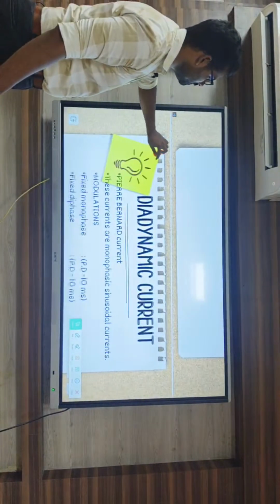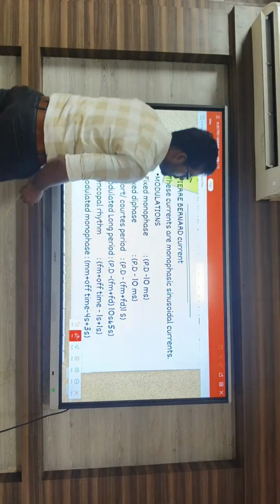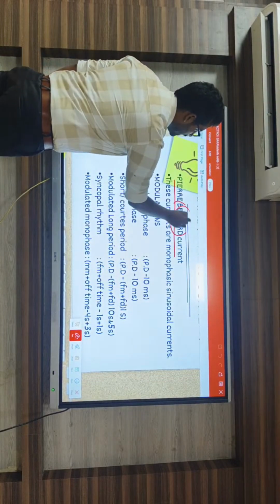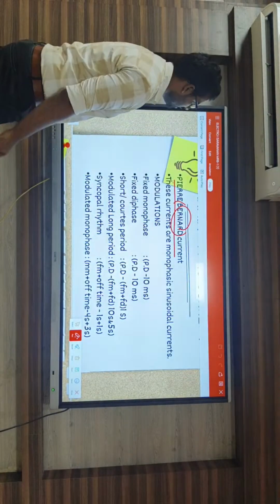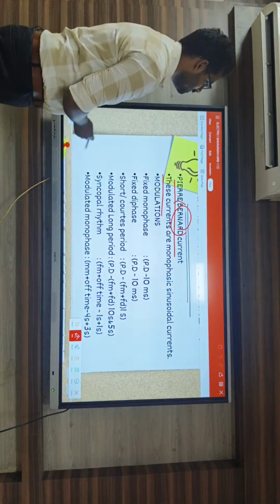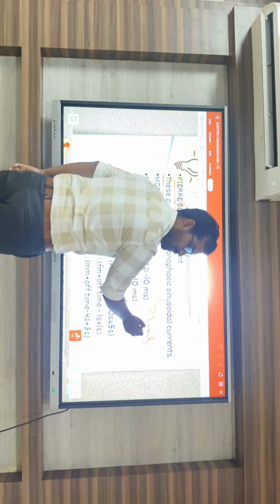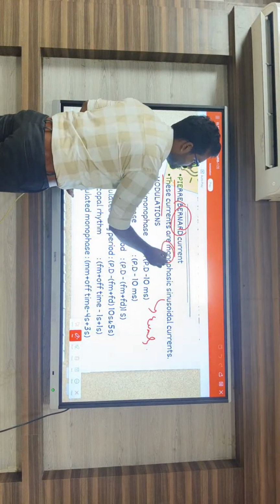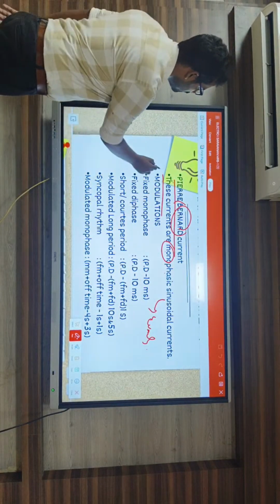Next we'll move on to the diadynamic current, otherwise known as the Pierre Bernard current. Bernard is the only candidate who produced it, which is why it is named the Pierre Bernard current. So what is the exact definition? These currents are monophasic sinusoidal currents. What is a sinusoidal current? An evenly alternated low frequency current. That evenly alternated low frequency current produced from single phases, that is the monophasic current, is the diadynamic current.